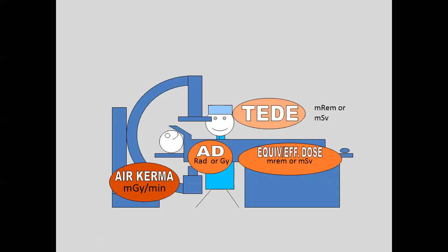And then your effective dose is going to be, all you should really do is irradiate the chest, okay? So in a couple slides, I'll show you how to figure out the effective dose from a cath, okay?